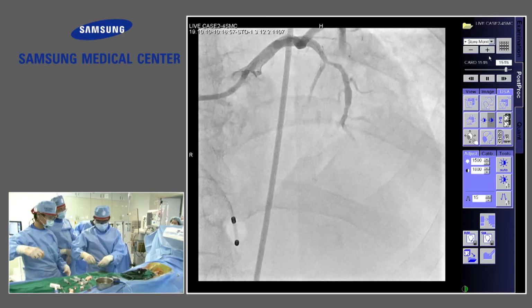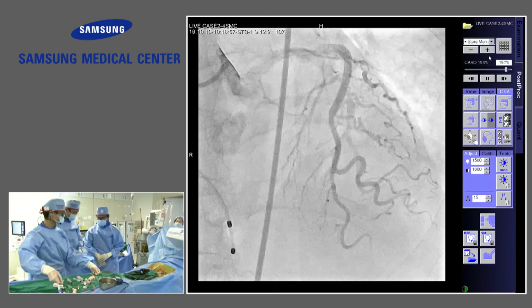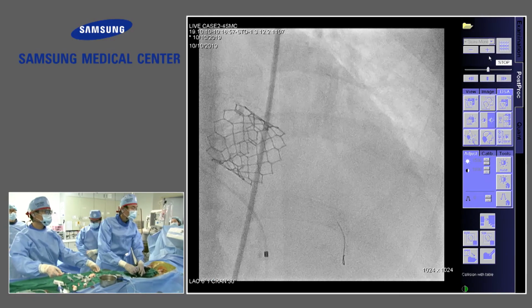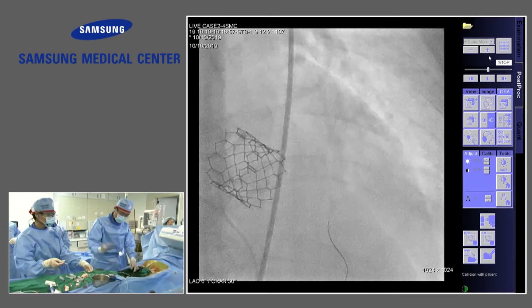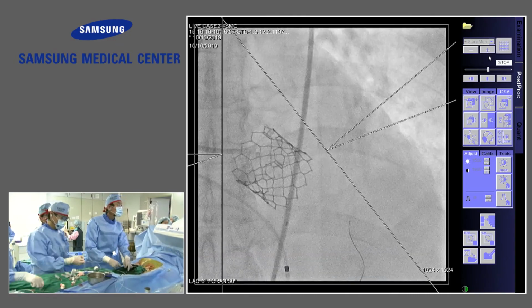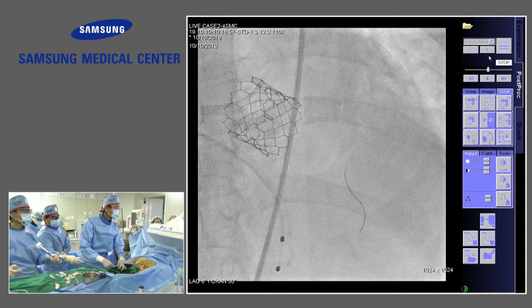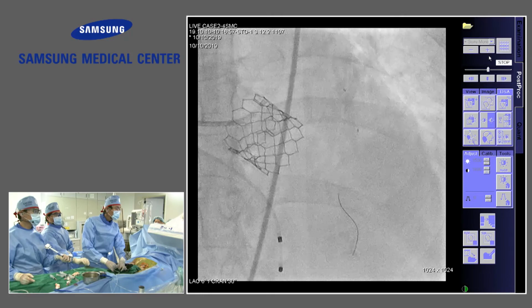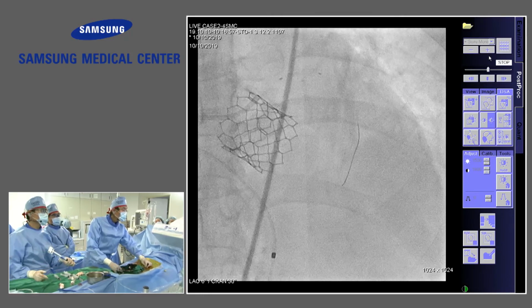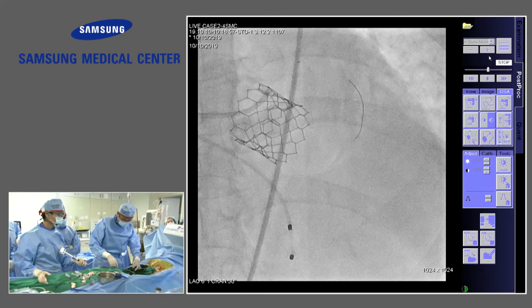I mean, it does have diffuse disease, even the bifurcation, prior to the bifurcation distally, but the most important lesion is at the septal, right after the septal. I think that while he is doing this, and this is boring, I'm kidding.